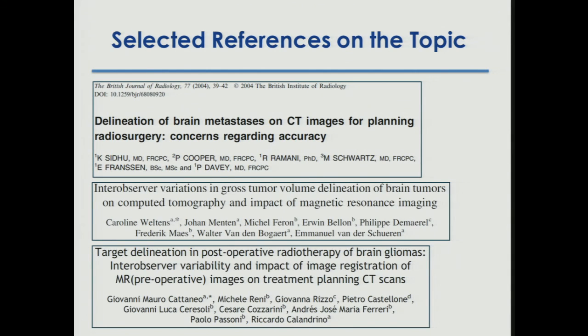And you will learn something very, very interesting about visual perception of what a target size is on a grayscale CT image. I can tell you that most physicians get a significantly larger volume. It's usually between 10 to 20% larger than the actual volume of that plastic ball. Do that exercise yourself. It's excellent learning.